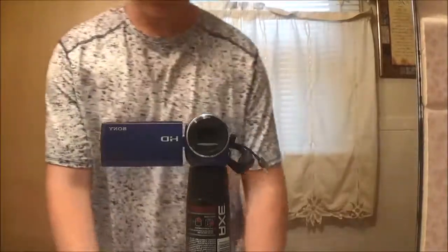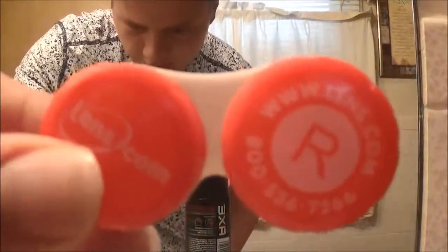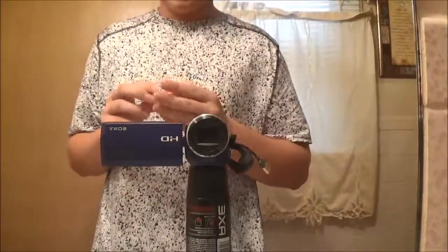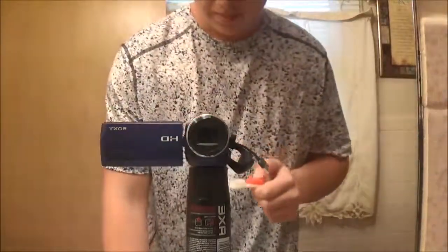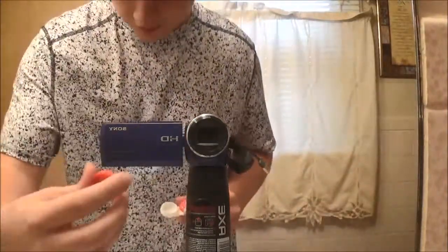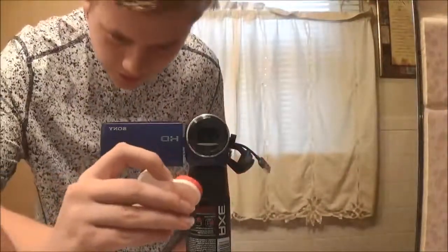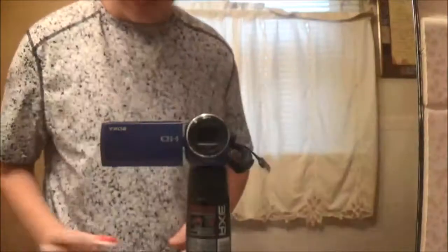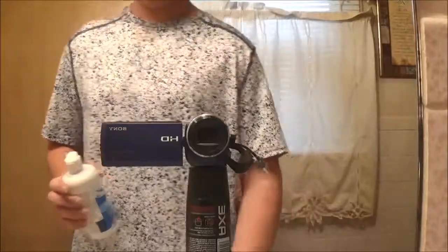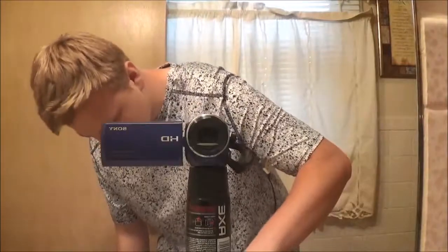Okay, so now we're at the final and last step. You've got your contact case. You can see it in this too, since it's a mirror kind of deal. Now you're going to remove the left cap off, or whatever eye you want to start off with. I prefer the left. So, left cap's off. Your first step is you're going to fill the left, and you're going to do it for the right too. You're going to fill it just halfway up.